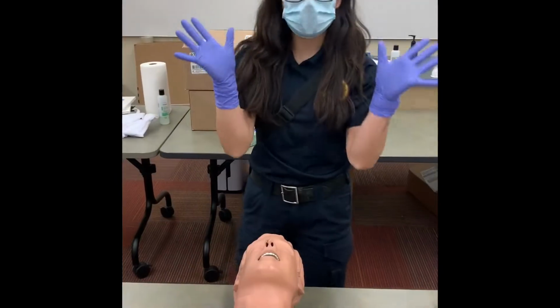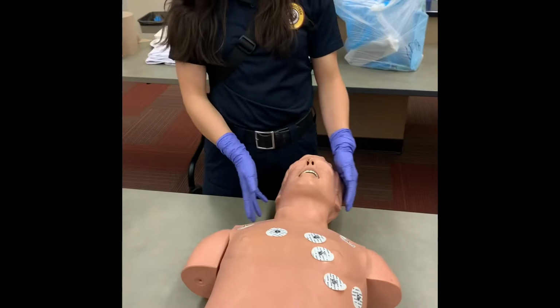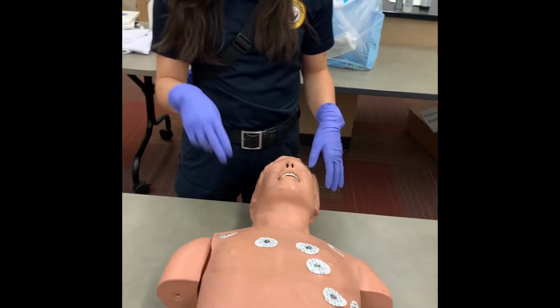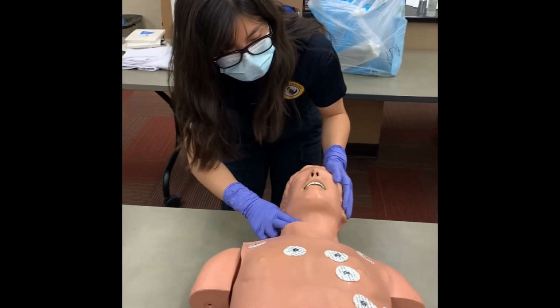Okay, so proper PPE. So, scene safe? Scene is safe. Okay. Hey, are you okay? Are you okay? No response. I'm gonna go ahead and request additional ALS, and I'm gonna check pulse and breathing. So the patient is unresponsive, apneic, and has a weak pulse of 60.